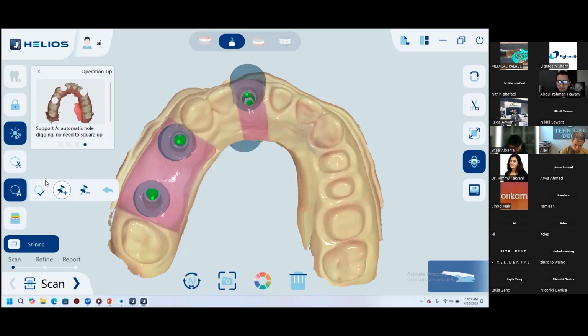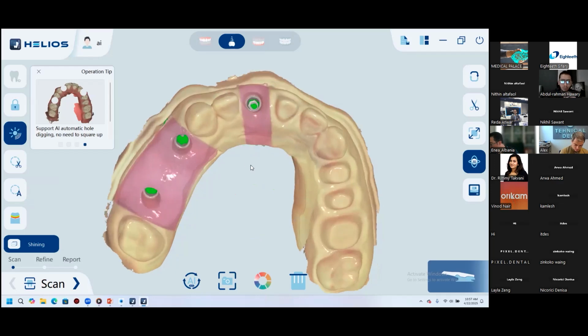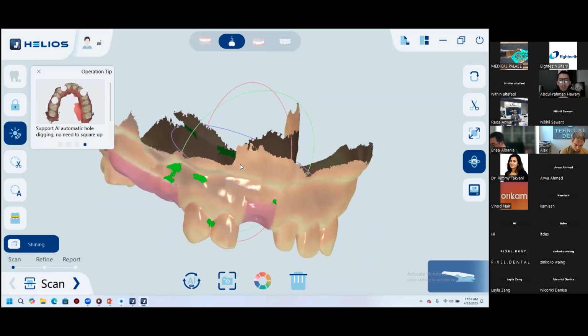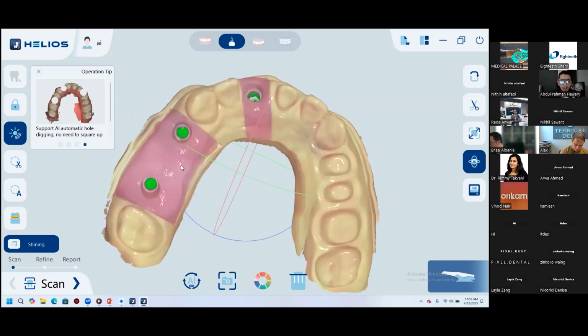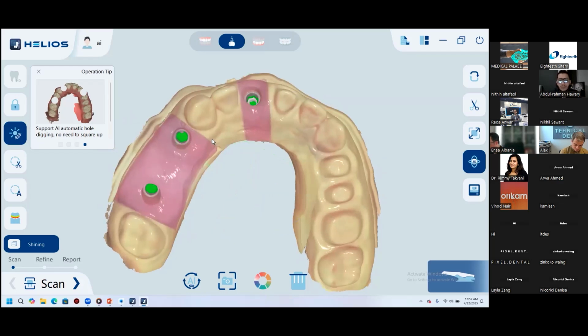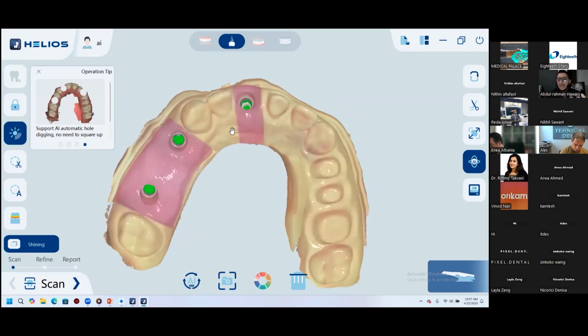Yeah, but my real question is, is it possible now with the software? So the software, no, you do not have the option within the software to tell it that you are scanning a denture, a triple tray, or a bite block or whatever. You don't have the option to tell the software to align itself automatically. But the scanner will never accept or reject scanning anything.